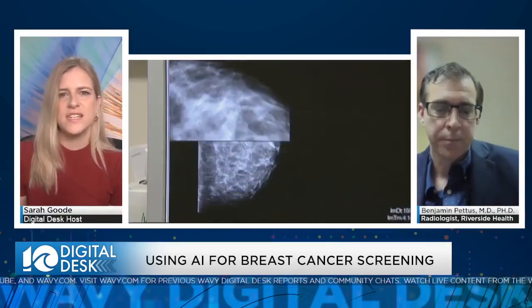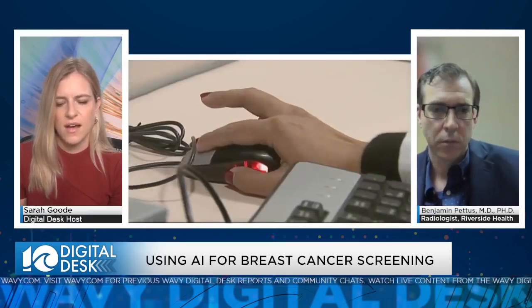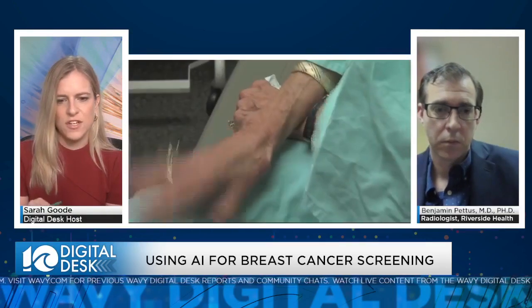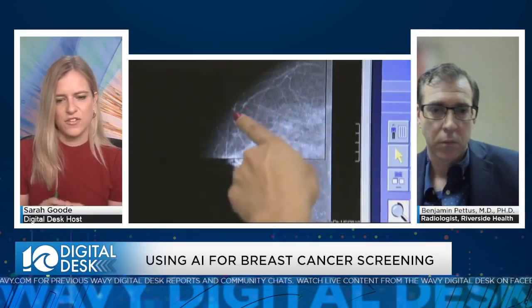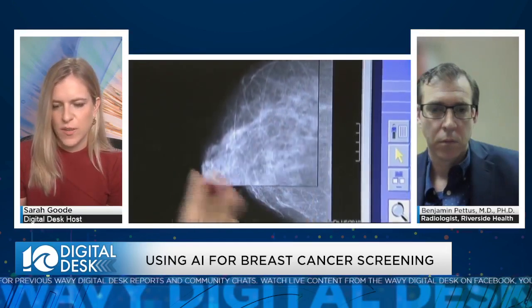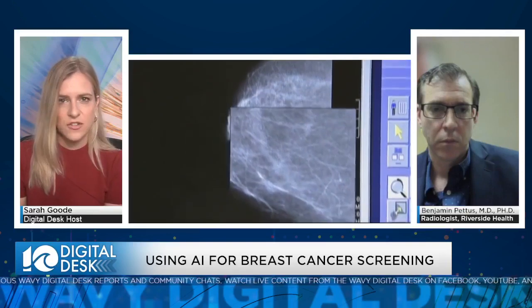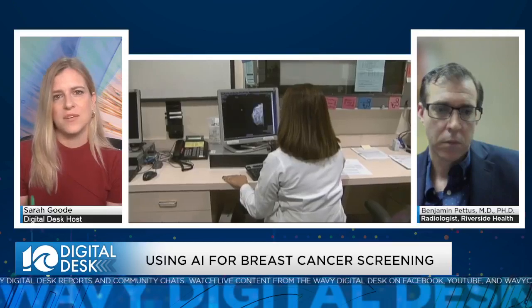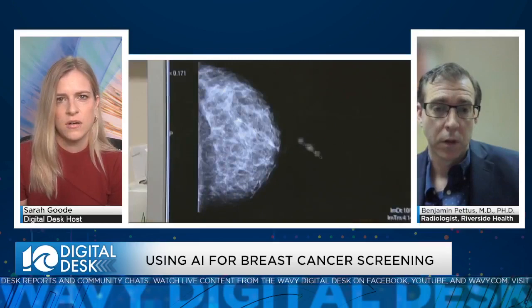Right. So you're using information and data to help that system as you all use it. I was curious, you just said everybody's body is different, which I've heard amongst screenings, and you mentioned different tissue densities. Is that why it's critical to follow the routine of getting these screenings done, because everybody is different, and you need to be able to see those changes over time if they were to occur? Yes.